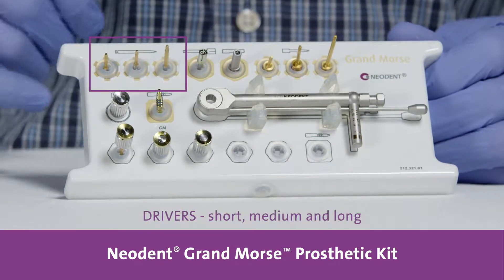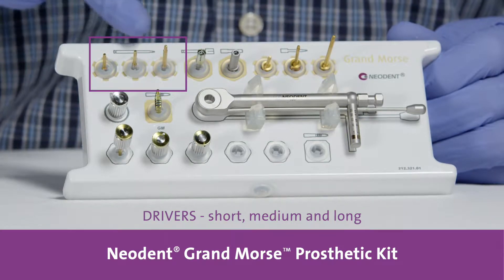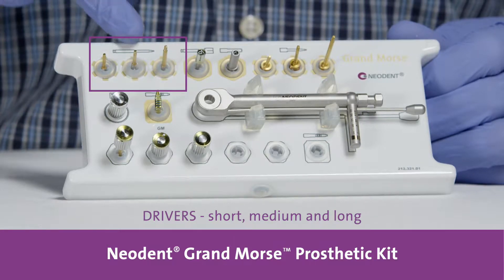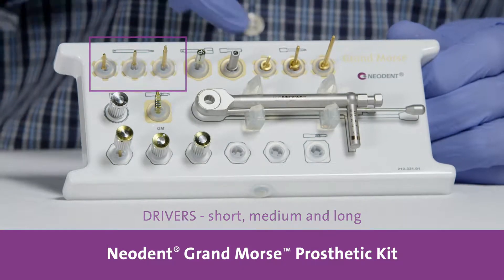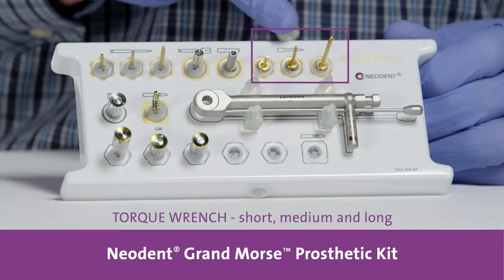Here you can find drivers for the new driver screw: for latch, short, medium, and long. The same thing for the torque wrench: short, medium, and long.